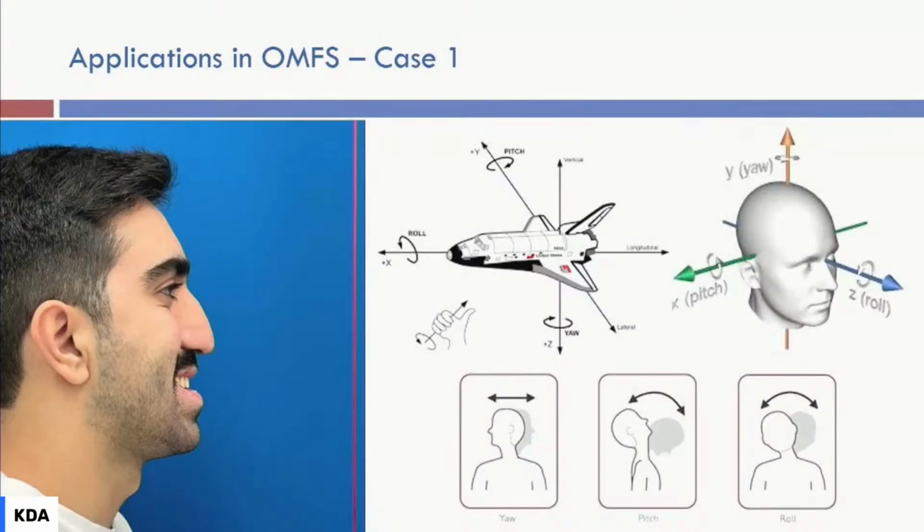The face is floating. No matter how the patient stabilizes himself, the face is in a three-dimensional space. It moves in different directions, and even with each picture that you take, you cannot repeat the same position easily. I'm talking about normal patients without torticollis or any other conditions. The regular patients cannot align their head easily, so you have to guide them.